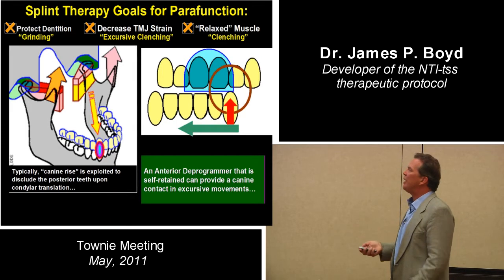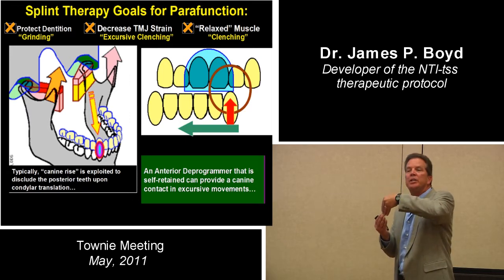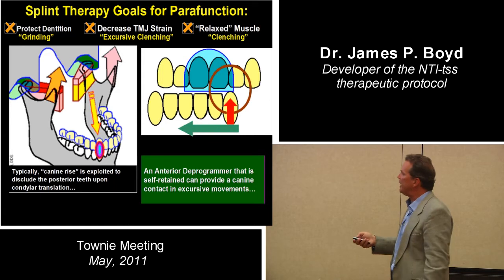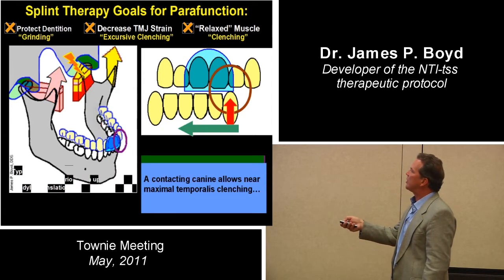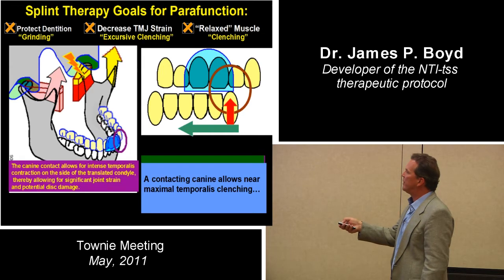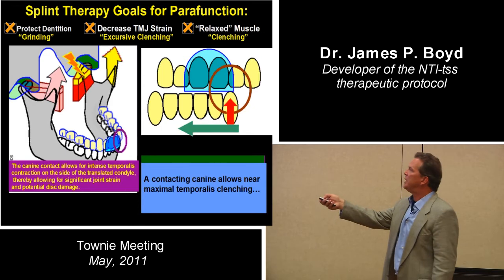And once they do that, now you've got a canine coupling. You've got circuitry completion through that canine. So clenching intensity can increase on the side of the canine contact. So there's a canine contact way over here after the mandible moves this way. So you have that condyle has been translated, clenching on the same side.